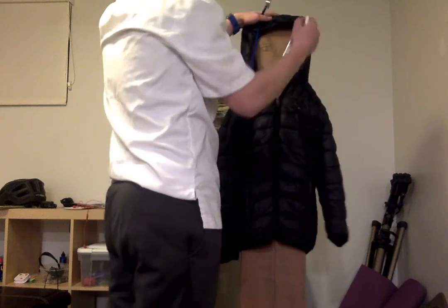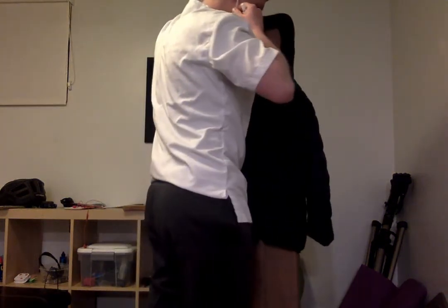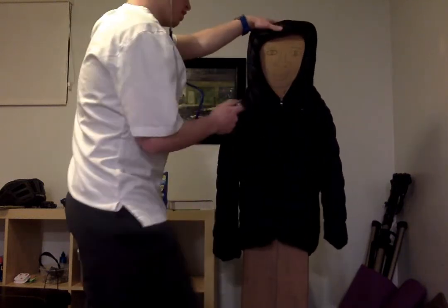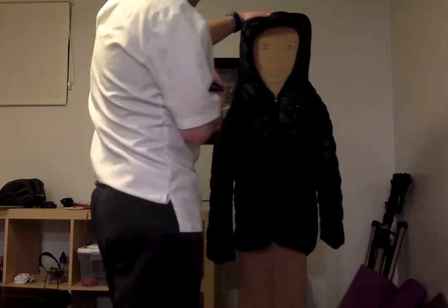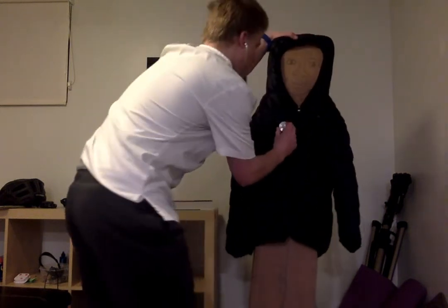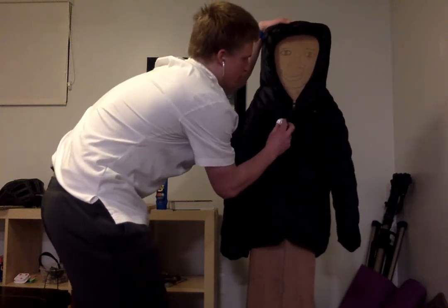So now we're going to listen to his chest. The first one I'm going to choose to do is listen to the heart. We'll say that he's shirtless just to give him some good form. The first one we're going to listen to is the aortic.